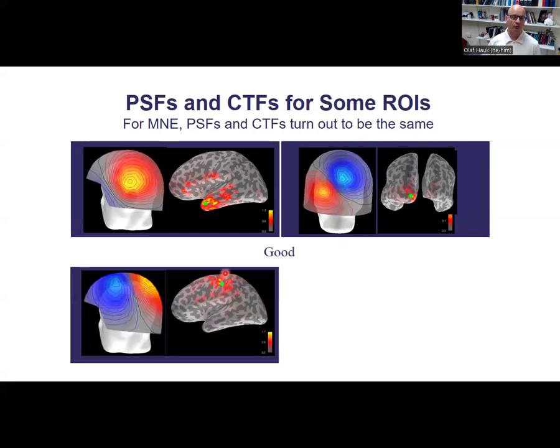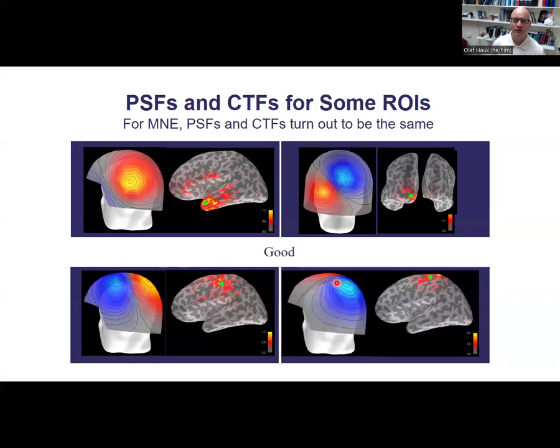This is something that could be in motor cortex. In this case, you are also sampling the topography pretty well, but here the peaks are maybe a bit further apart than for the occipital lobe, so that's why it's a bit more widespread here. But still, I would call that a good point spread function, at least centered around the green circle. And finally, maybe a bit further up, that could be leg motor cortex or something like that, closer to the vertex. It looks similar, I would say.